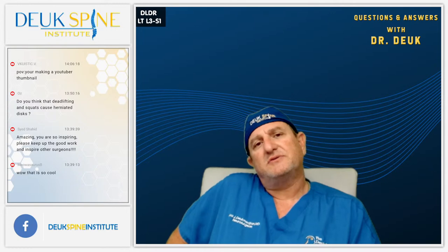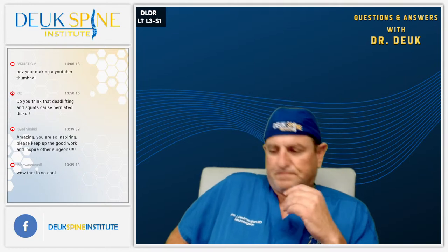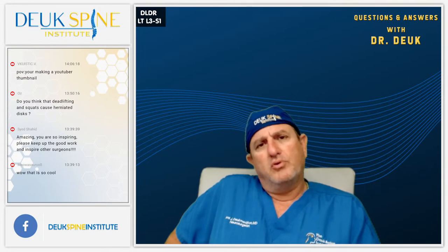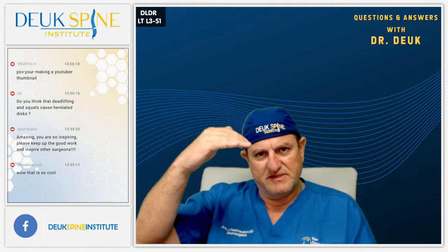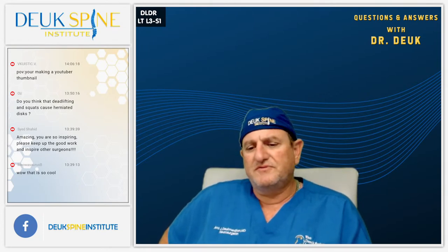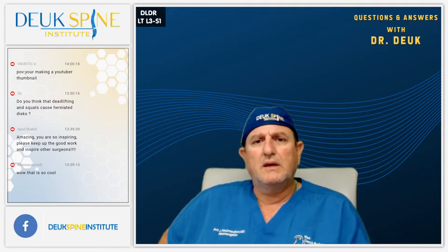We also discovered something else important today that's going to revolutionize healthcare again, and that is the use of CPAP during max sedation. The biggest risk for patients having an unsecured airway and propofol sedation while prone, laying on their belly looking down, is that the propofol could shut the brain down completely to the point the patient stops breathing. And then it becomes somewhat of an emergency. It's very easy to do that with this type of sedation. It's standard sedation. Everybody does it. But the risk is always there. You don't want that risk to be there.